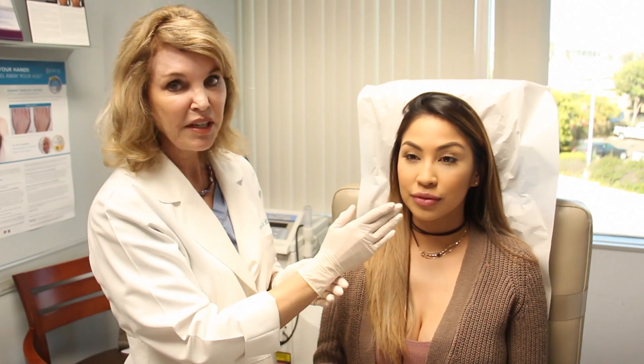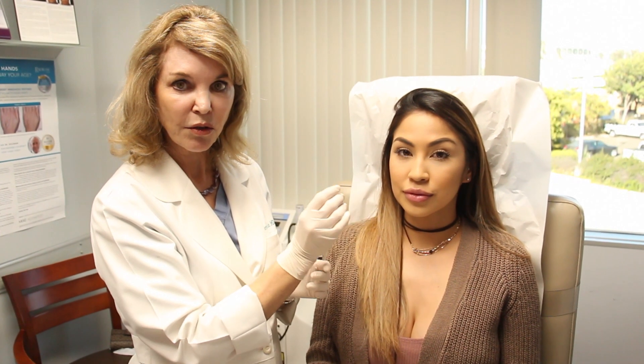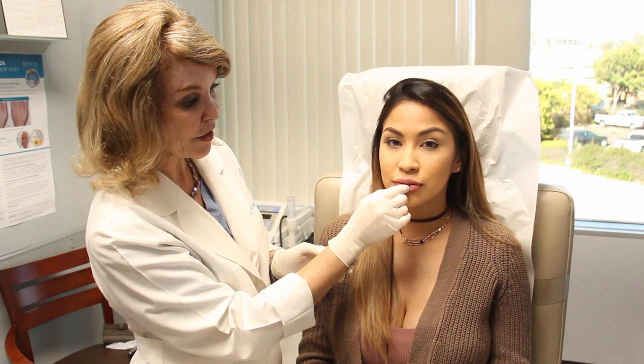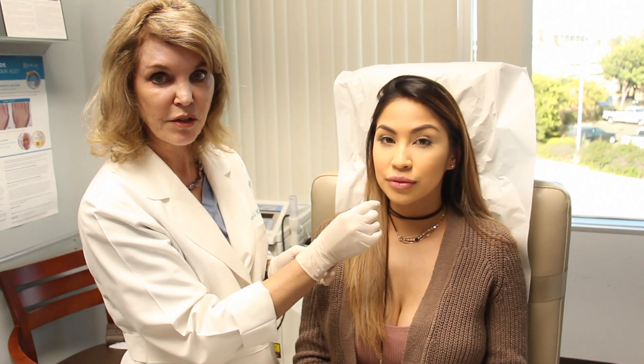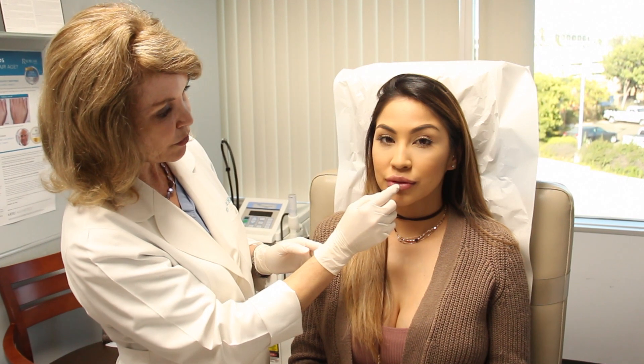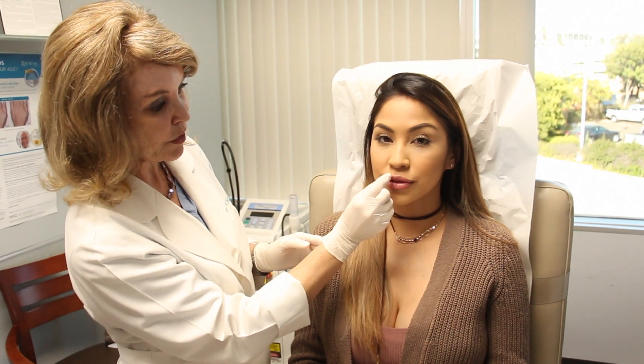Now we're done, and because of swelling we can't see the indentation of the keyhole, but it's definitely there. She's going to train it herself over the next few days with a ribbon — she'll pull that through several times a day — and we'll get to see the four pillows of the lip, especially in the lower lip where she wanted it. So stay tuned.